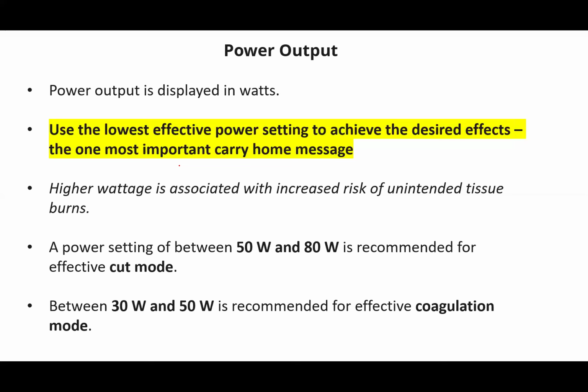So don't think that all the time you need to set your diathermy at a very high level to achieve an effect. No, remember it has a side effect on your tissue. Higher wattage is associated with increased risk of unintended tissue burns.